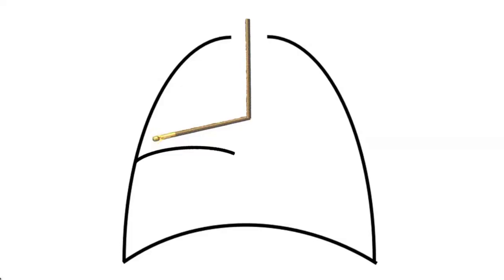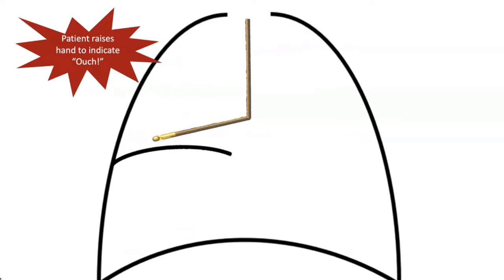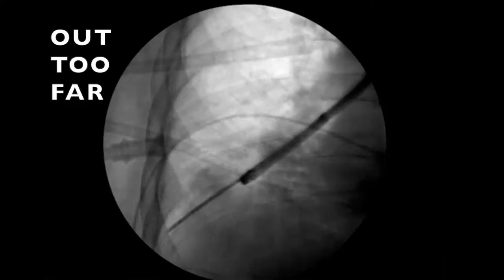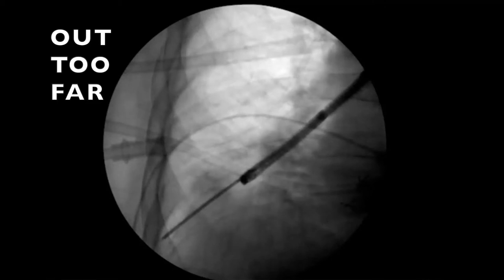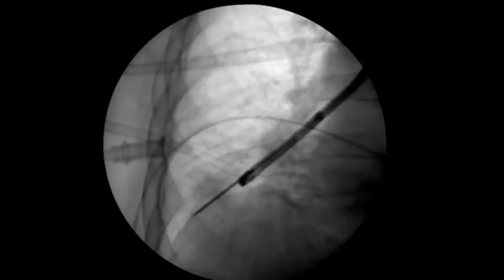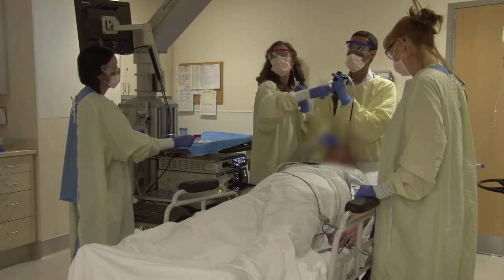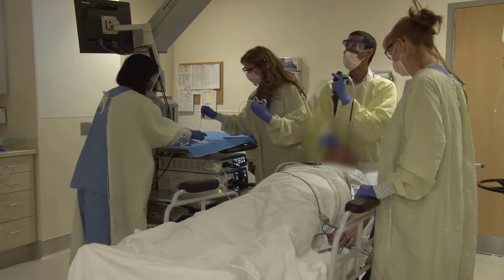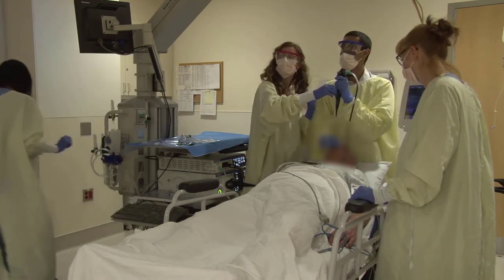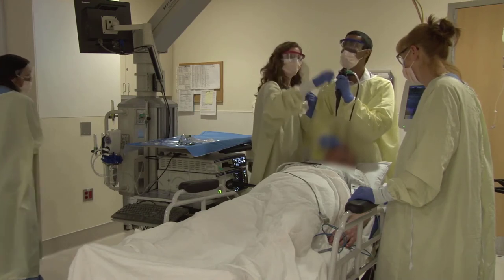In that case, you should open the forceps, allow the patient to inhale, then close and withdraw to try again. Fluoroscopy has not been demonstrated in the literature to effectively decrease the risk of pneumothorax, but many providers use it in part to help them identify when their forceps are far extended, close to the pleura. Finally, many providers feel that using an aggressive biopsy technique, in which the forceps are quickly and forcefully withdrawn, can increase the risk of pneumothorax. This is subjective rather than data-driven, but most providers agree a more gentle pull provides adequate yield with less risk.